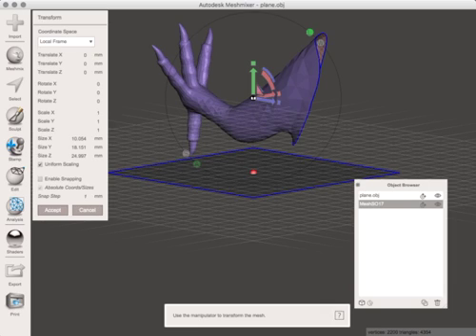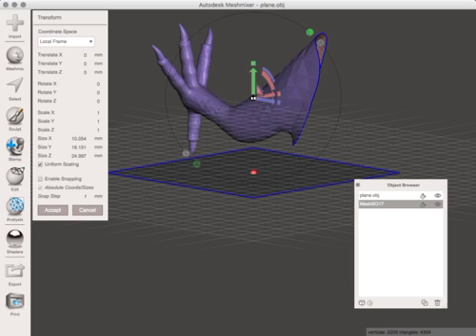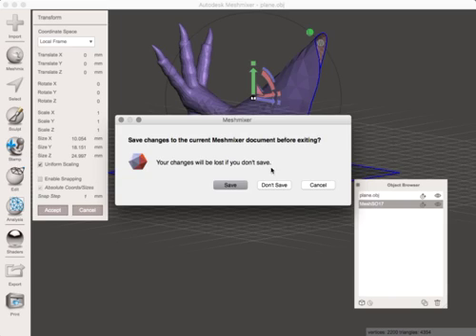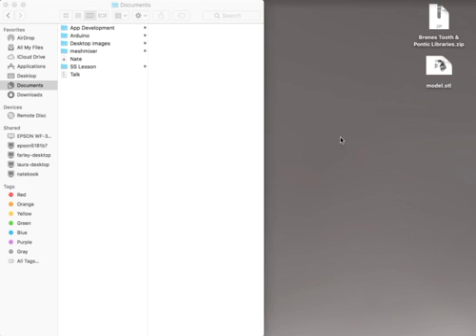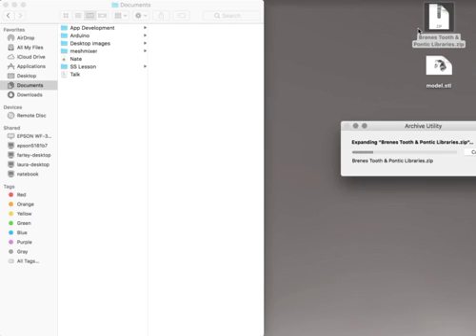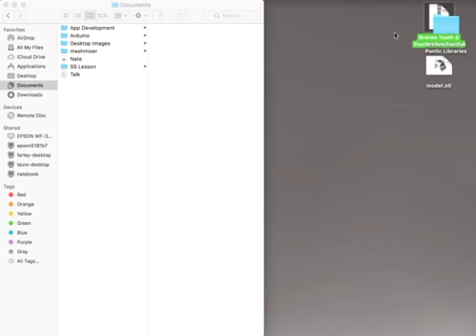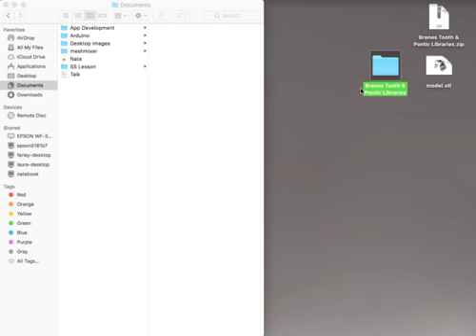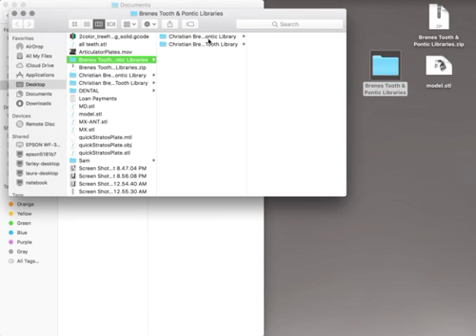So the first thing you're going to want to do is just close out of MeshMixer. Right here, this is what you're going to be able to download from Christian, and that's a zipped folder that has two different folders in it.